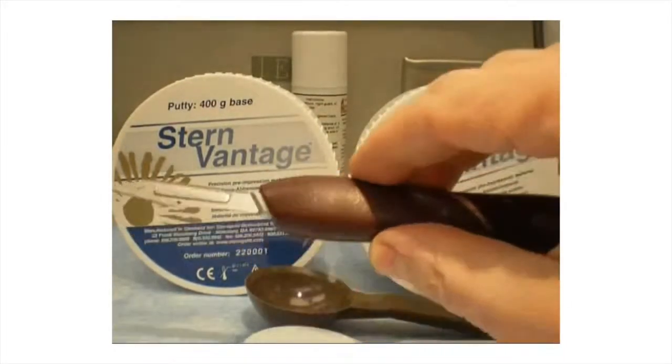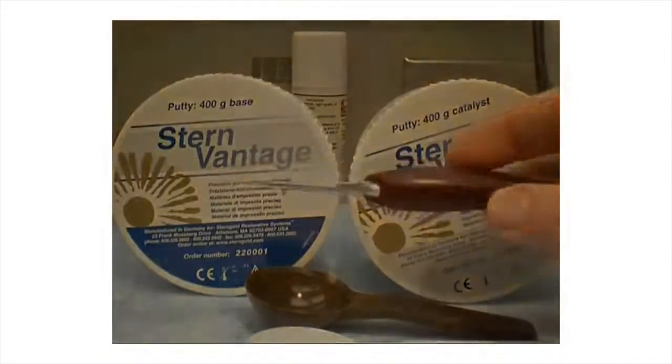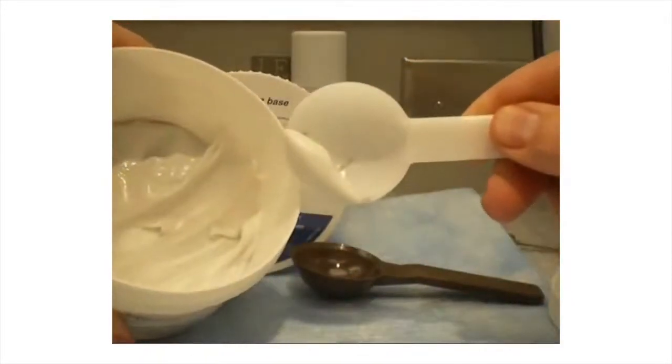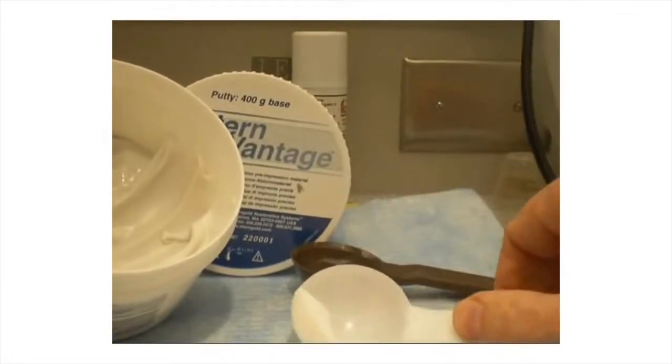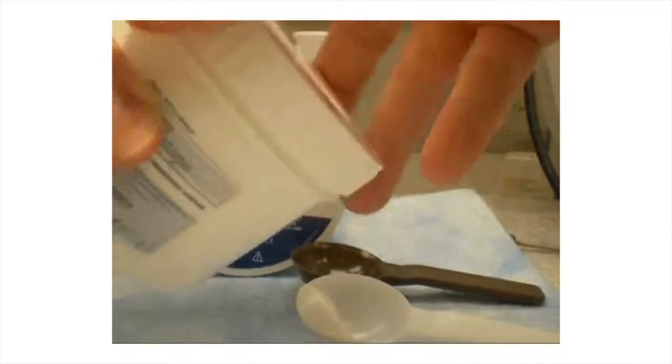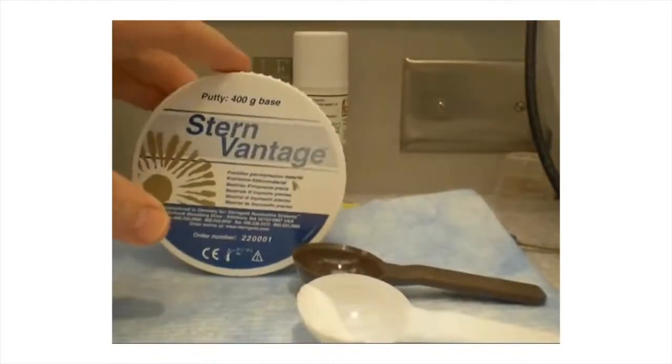Making a Putty Reduction Guide. A putty reduction guide is useful in evaluating crown preparation reduction. Small, equally sized increments of polyvinyl putty base and catalyst are thoroughly mixed together to form a homogeneous mass.